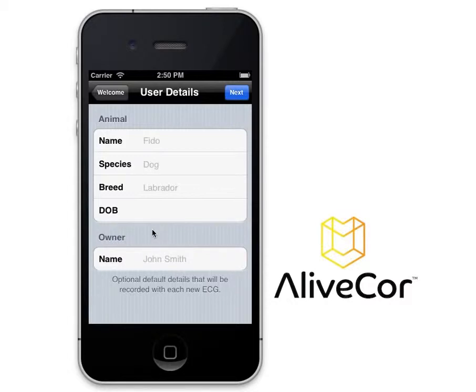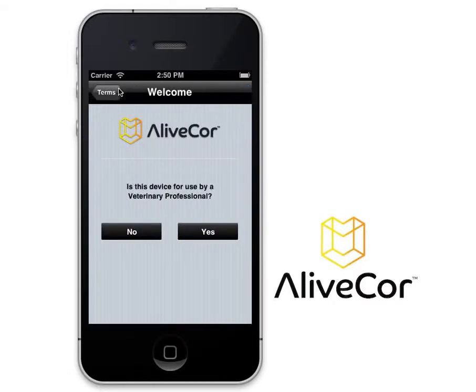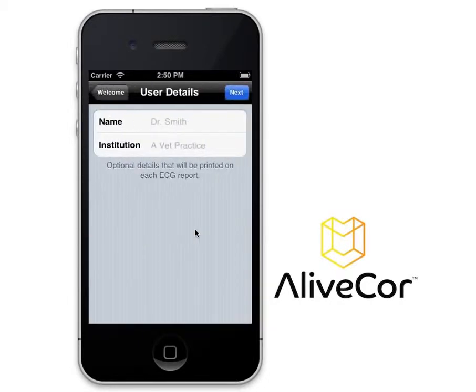This information will appear at the top of each ECG report you generate. However, if you are a veterinary professional, you will want to tap Yes in response to this question. You may enter your name and the name of your veterinary practice, and this information will appear at the top of each ECG report you generate.